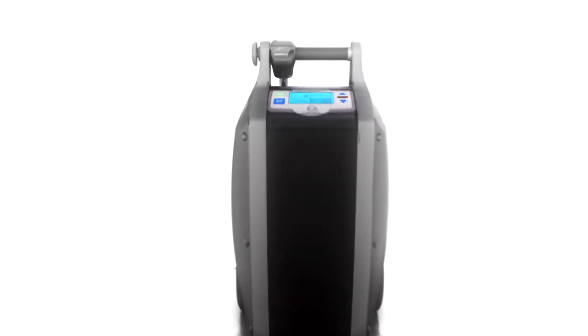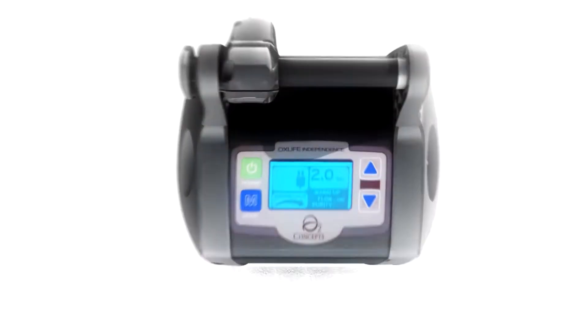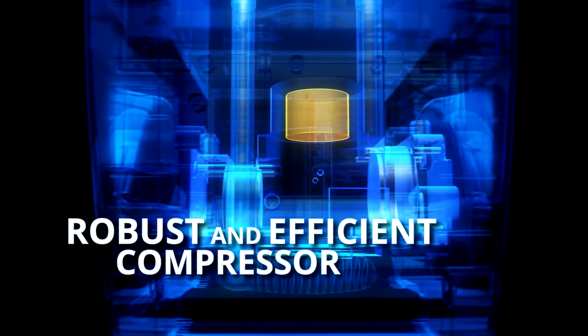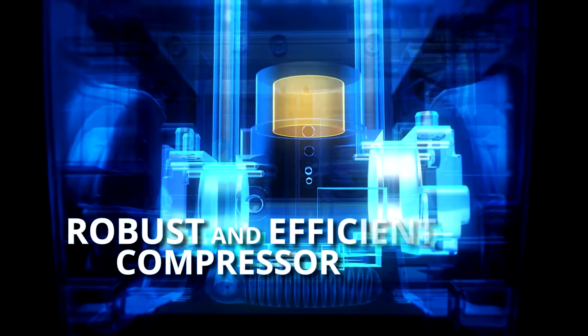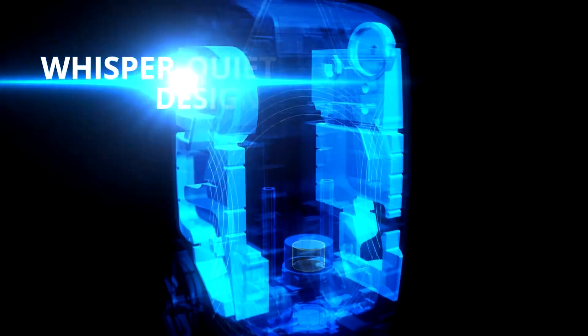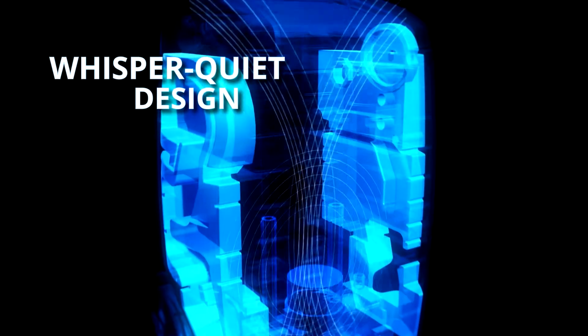What goes into a superior portable oxygen concentrator? It requires a compressor that combines power with simplicity using brushless motor technology to enhance durability. A foam coated interior that more efficiently cools the machine while reducing noise to a whisper.